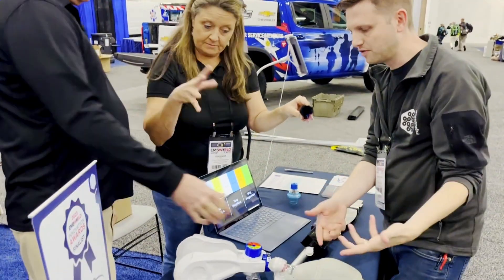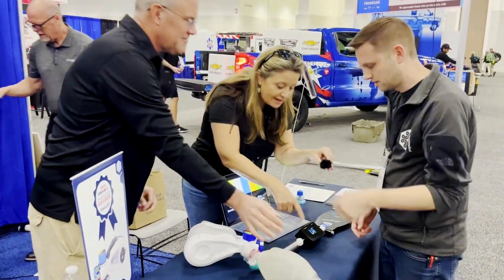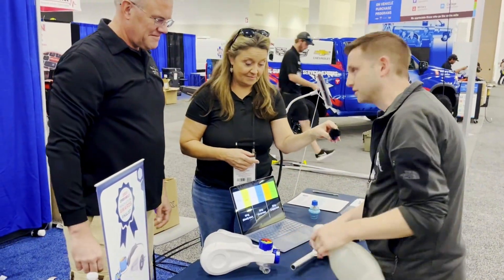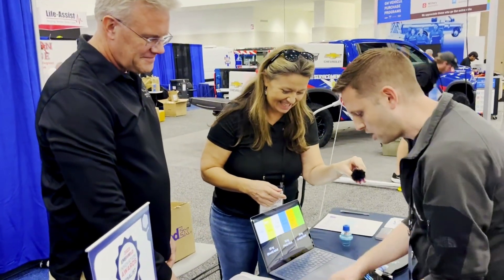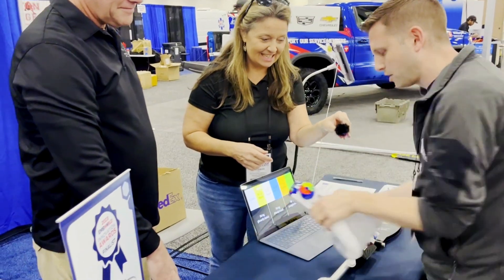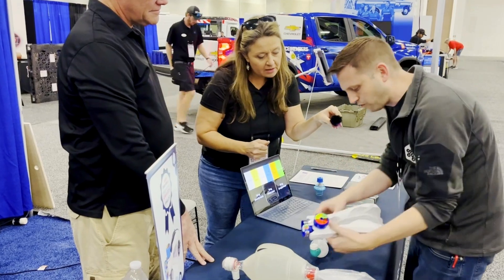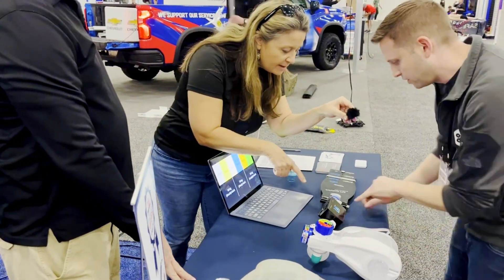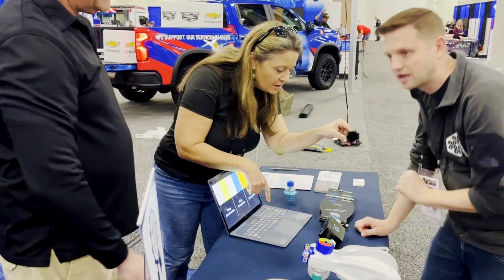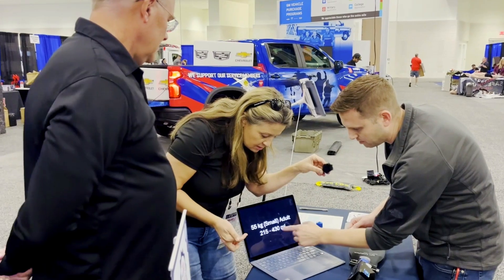There's nothing that stops you — that's exactly what they're taught. And if you go more, the max is over a liter — 1,036 milliliters. With the Butterfly BVM, you'd go on a run and instead set it on small adult, keep your PIP on 40, squeeze — and we just delivered 361 milliliters. If you look here, 361 mils is right in that 4 to 8 ml per kg range for that patient.